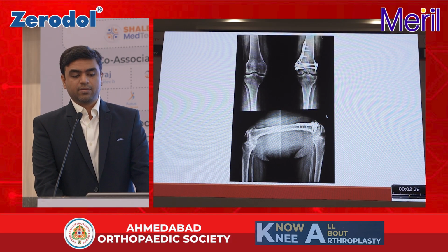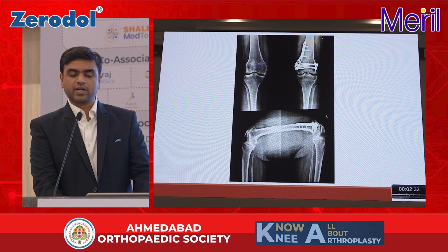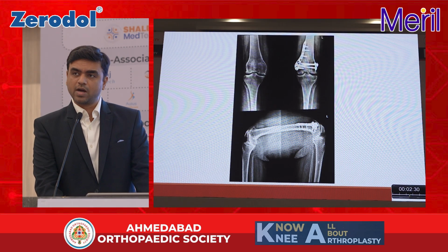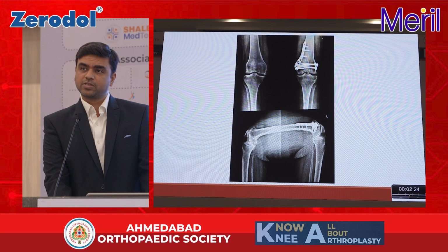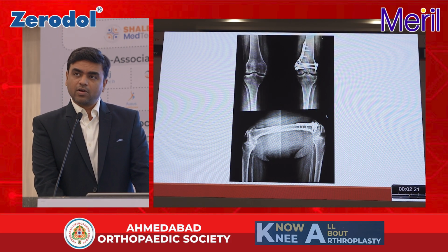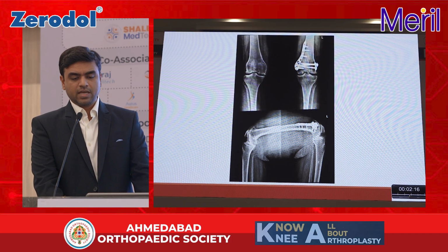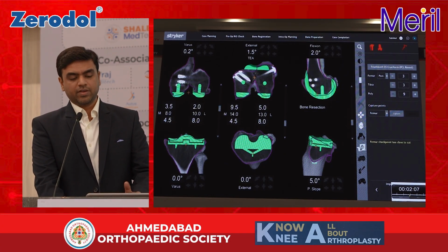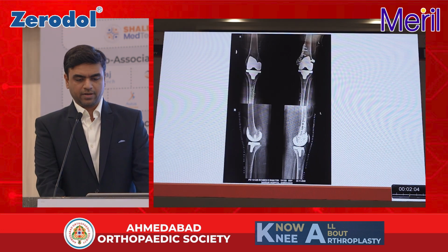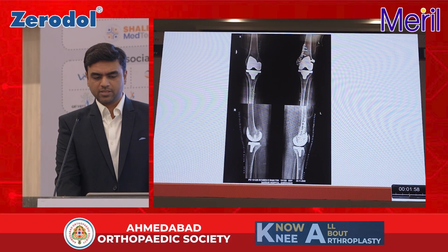There is another case where a patient had a distal femur fracture 3 years back. After fixation, she had post-traumatic osteoarthritis along with a good amount of stiffness, and she had a very high amount of osteoporosis as well. So removing the whole hardware and putting in a rod in the femur would lead to an extensile surgery, extensile blood loss. We avoided that by using the same system again, and I could identify all the hardware where it would come in between. We went in with a CR knee, didn't remove a single piece of hardware in such a case. And we had an equally good result on this bilateral as well.